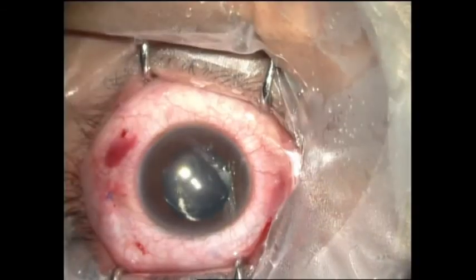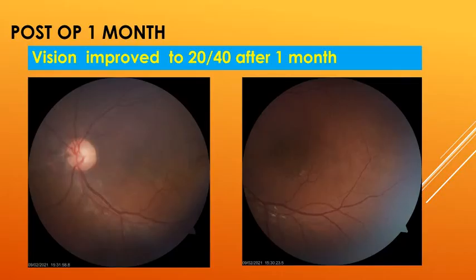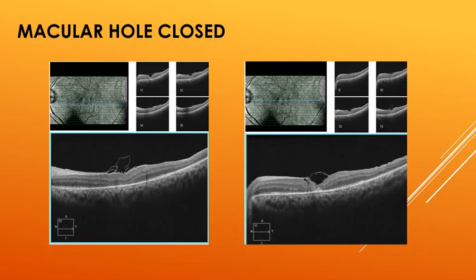The eye was closed and 1 month post-operatively the visual acuity improved to 20/40 and the macular hole closed.